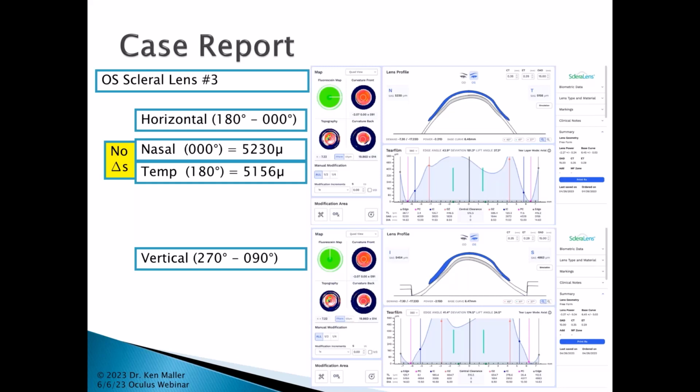You don't need the data out there at all, and the only reason I brought it up is that when I was using the standard CSP, I would consistently get out to probably 16.5 to 17 millimeters. On a rare occasion, I can get a little further than that, but you had to have a very cooperative patient. 16.5 millimeters, though, is just about where the meat and potatoes of where you'd be fitting a lot of these scleral lenses are going to be in terms of diameter. And so if it's 16.5 millimeters and you start getting a little bit iffy in terms of the reliability of the data out there, that might concern me a little bit.